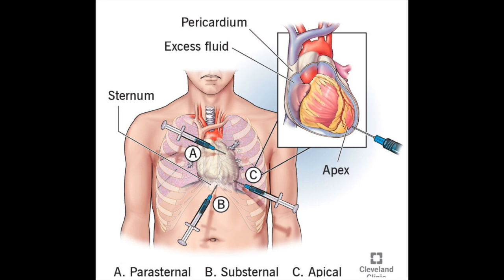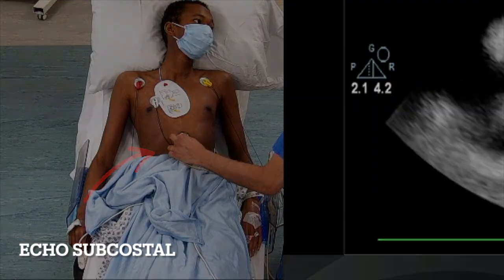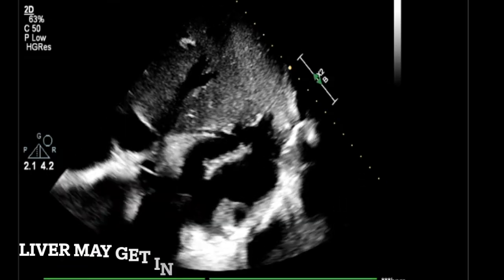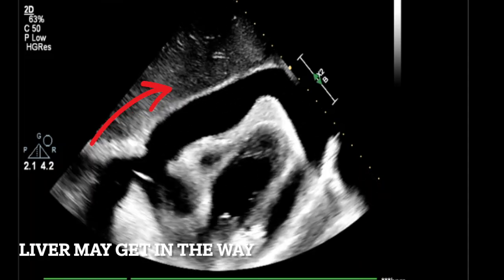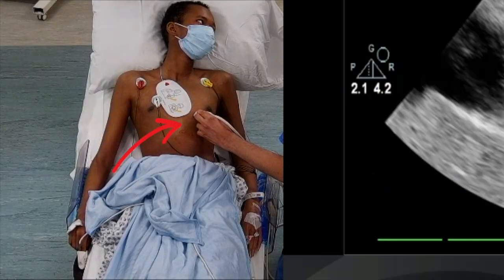Position A is next to the bone at the sternum, position B is under the ribcage, and position C — my favourite — is at the apex of the heart. Here's the subcostal position under the ribcage: you can see the fluid as a black shadow with the heart wobbling in the middle. The problem is there's greyish matter above, which is the liver — a very vascular organ that could bleed if hit. So in many instances the subcostal view is not the best position.